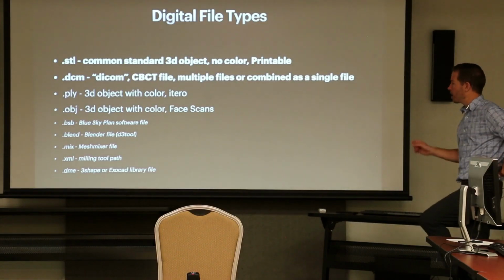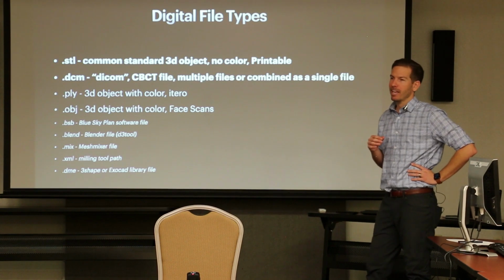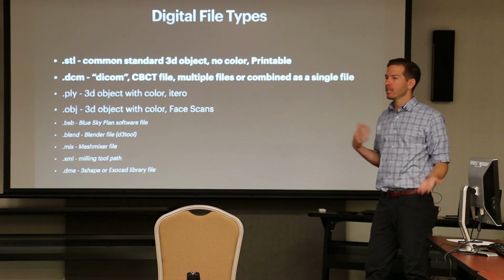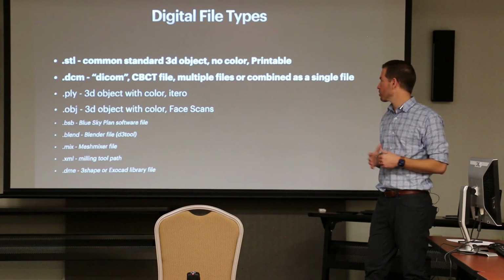So I think it's important, just getting into this stuff, is just understanding file types. Because I can teach you where to click on software, but if we don't understand the why and what this file type is and how these interact, it's harder to keep pushing faster. I think it's important to know the why behind it.